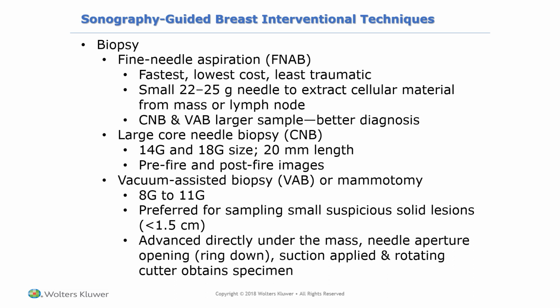So a large core needle biopsy is almost like a gun, like the long fire starters for your fireplace, where you pull the trigger and it starts the fire. These look very similar to that. So with these large core needle biopsies, they would insert the needle end of that gun into the mass, or to the margin of the mass, and then when they liked their placement, they would fire that biopsy gun, and it would send out a large bore and take a bore of tissue sample, pull it back, and then they would test that tissue sample.